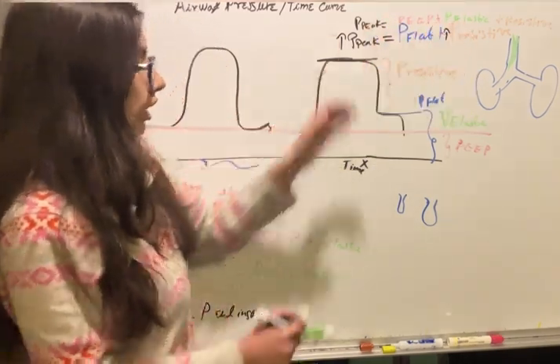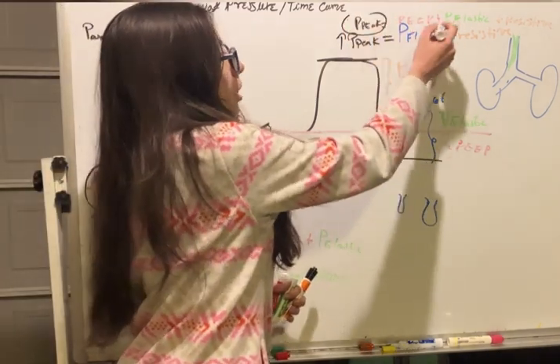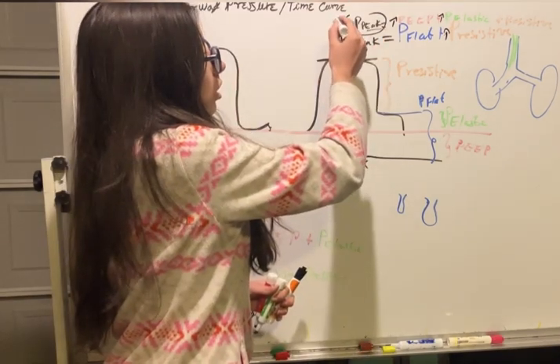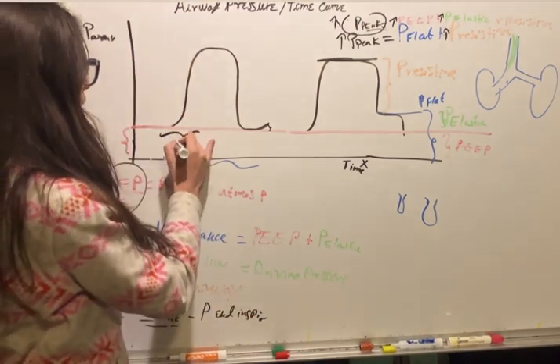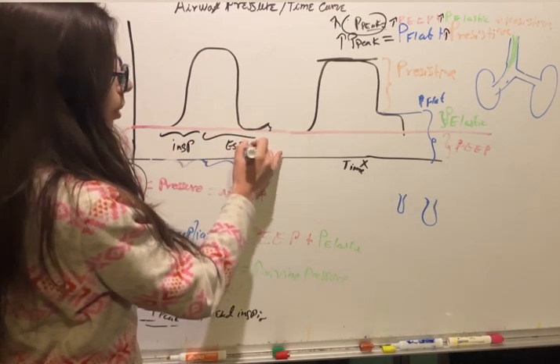This is going to increase the peak inspiratory pressure. So here this is during inspiration. This is during expiration.